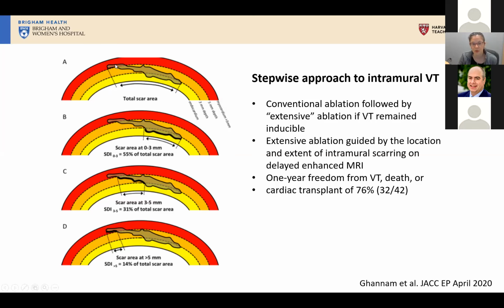And the reason this is important, if you think about what you're able to measure with voltage mapping, it's pretty unlikely that you're going to be able to assess scar tissue that's several millimeters away from your catheter in an accurate way with just standard, particularly with bipolar voltage mapping, and unipolar voltage mapping is often not discrete enough to identify these small scars.